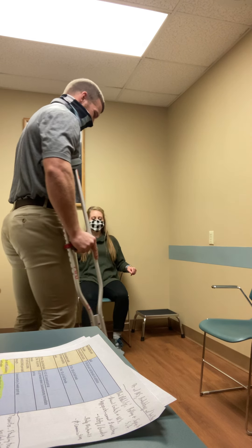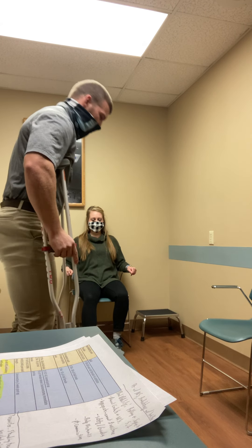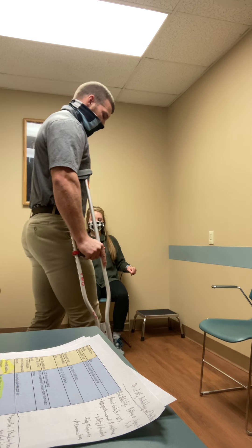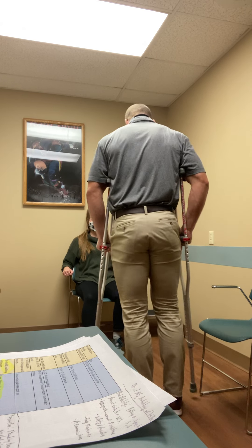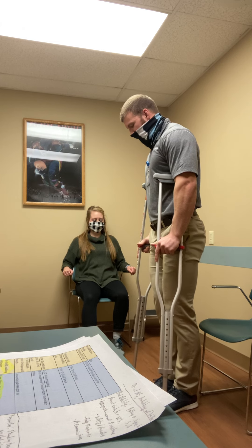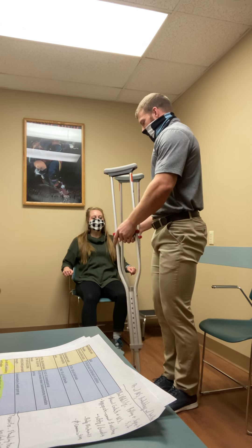One more time: weight through the hands, not resting on the crutches. Bring the crutches and the foot together, nice and easy. The big thing is you don't want the crutches to be perfectly at your side — you want about six inches out to the side for a good base of support.